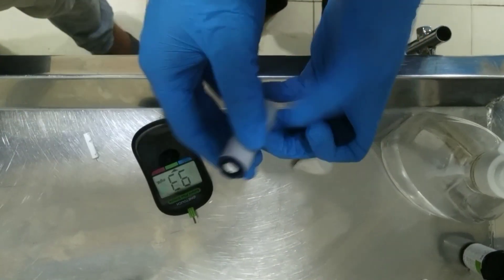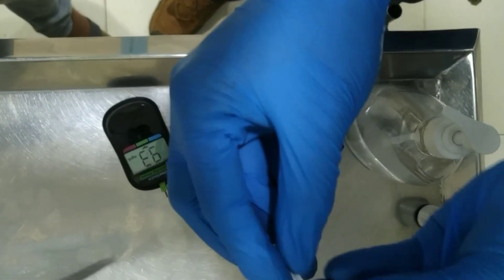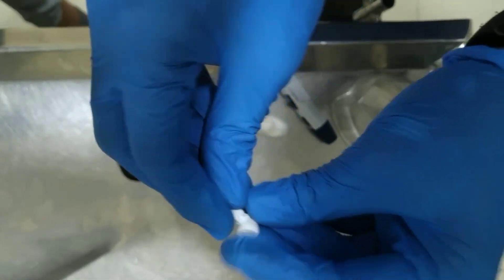After checking, the lancet and the strip should be disposed of properly to prevent contamination.